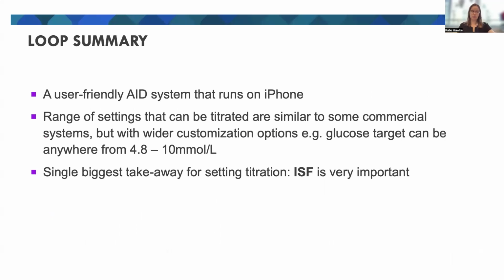So to summarize Loop before we move on to our next system, Loop is a user-friendly AID system that runs on iPhone.